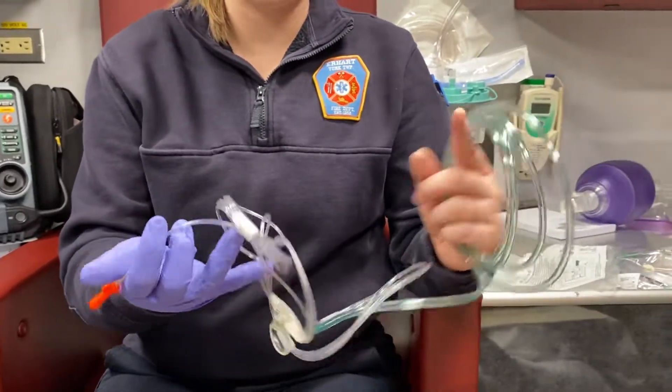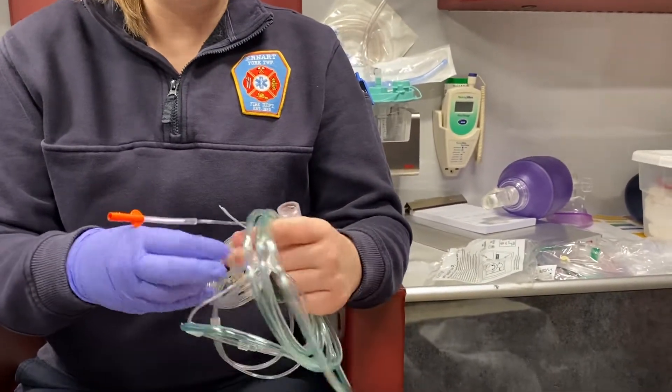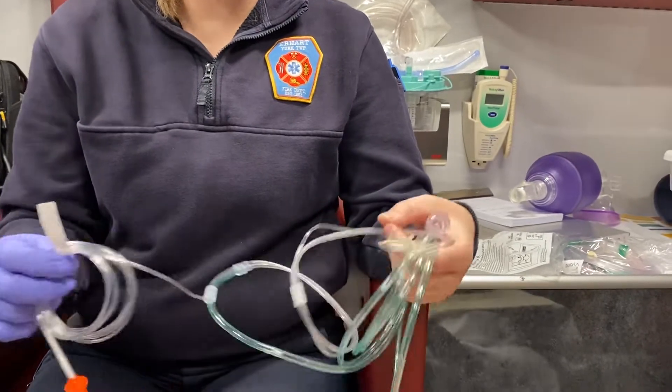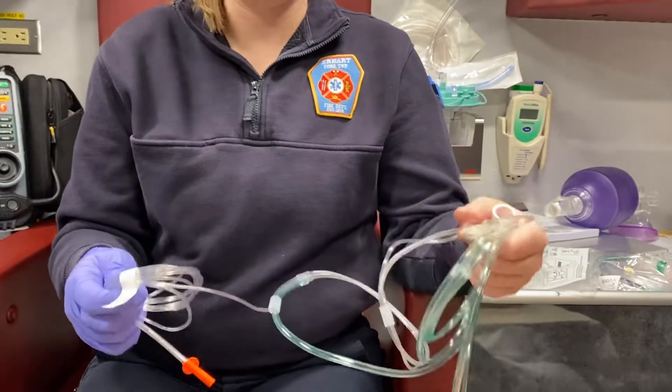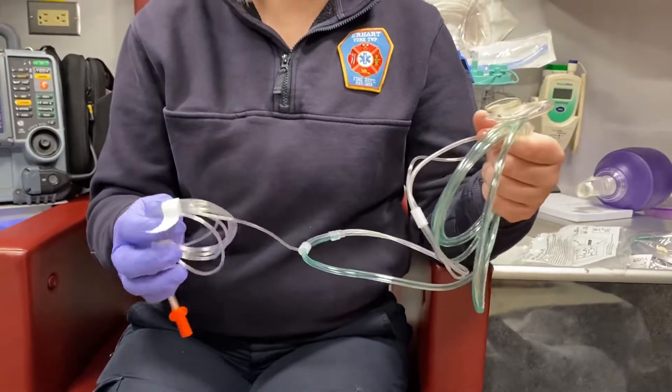This white tube is going to plug into the monitor to get your waveform capnography reading. You don't have to use the waveform capnography — it'll still function as a nasal cannula without it. You can also use it as waveform capnography without putting on oxygen.